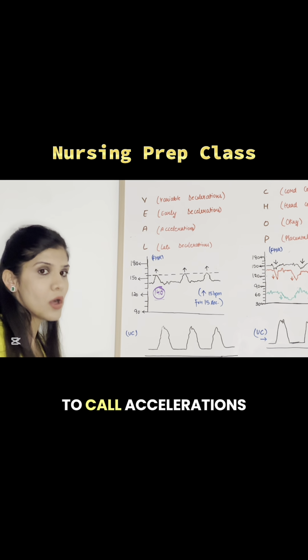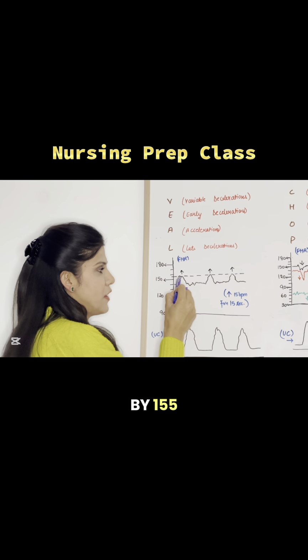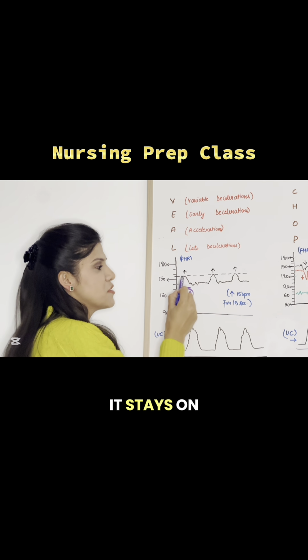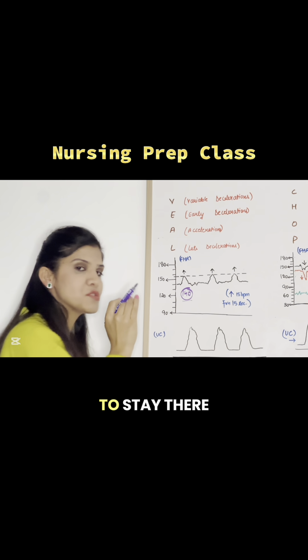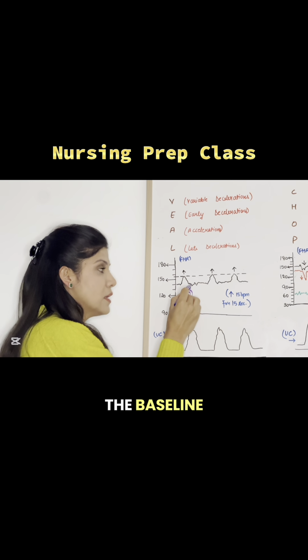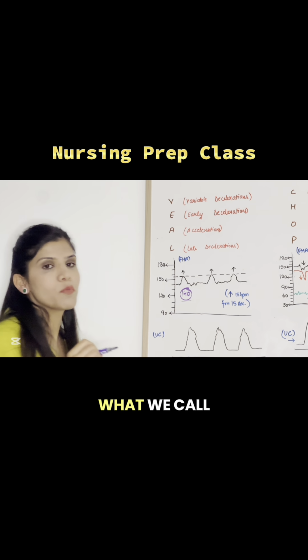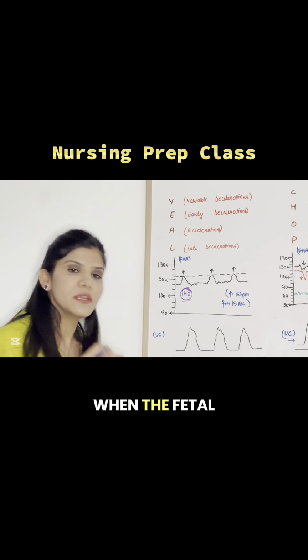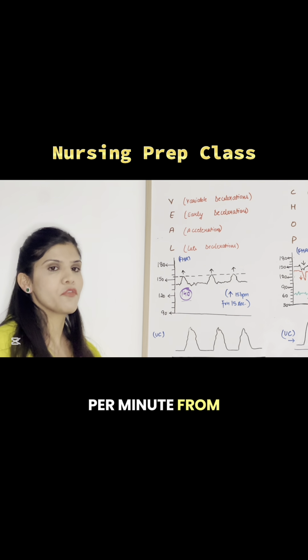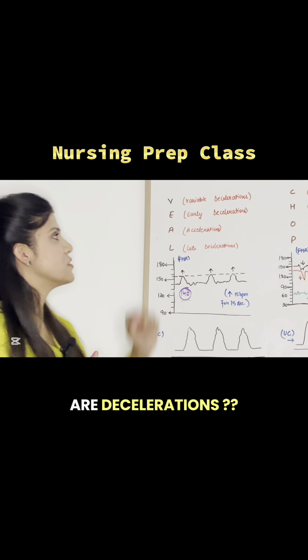For it to be called an acceleration, the heart rate here is increasing to 155, slightly over 150. It stays at 155 for at least 15 seconds before it starts coming down to the baseline, and then it stays on the baseline before going up again. This is what we call acceleration, when the fetal heart rate increases by 15 beats per minute from its original baseline. So this is acceleration. Now what are decelerations?